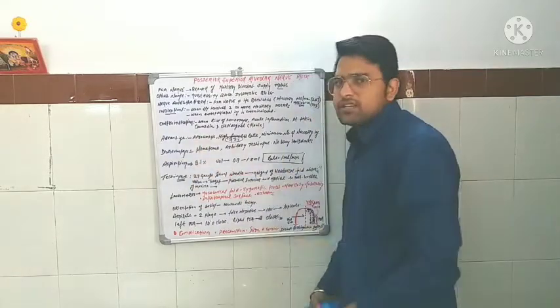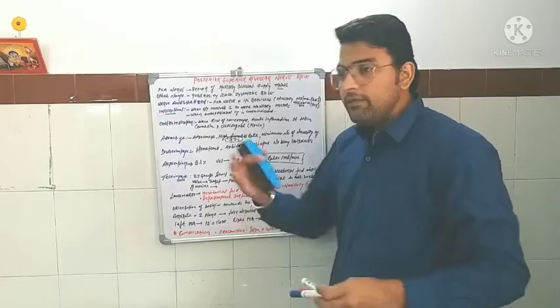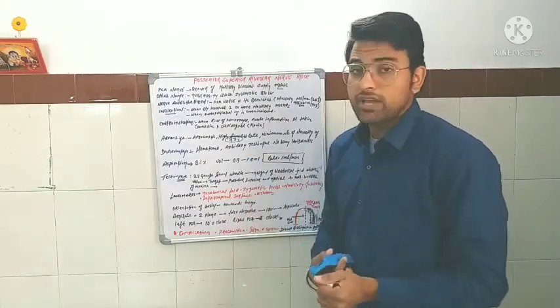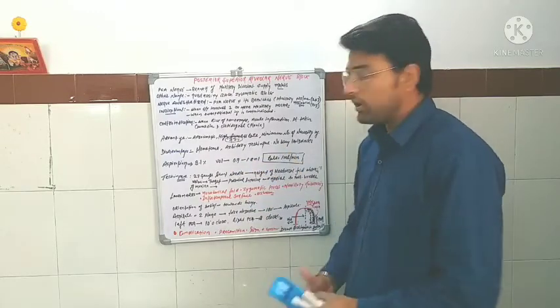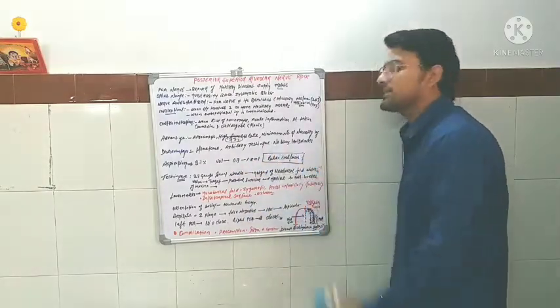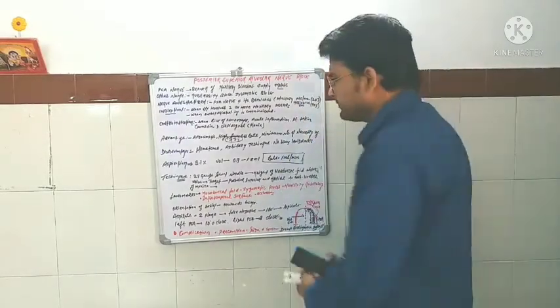The disadvantage of this nerve block is the serious risk of hematoma. When we discuss the technique, I will tell you how the hematoma can occur. It is a blind technique, and one very important thing is there are no bony landmarks. We just insert the needle in the mucobuccal fold.